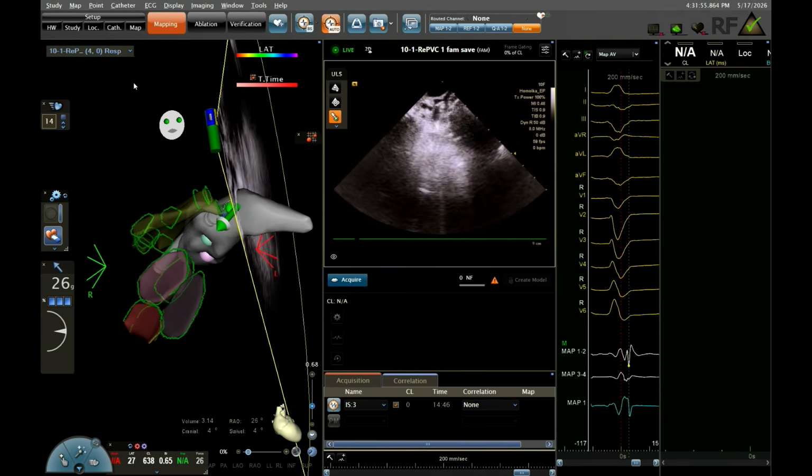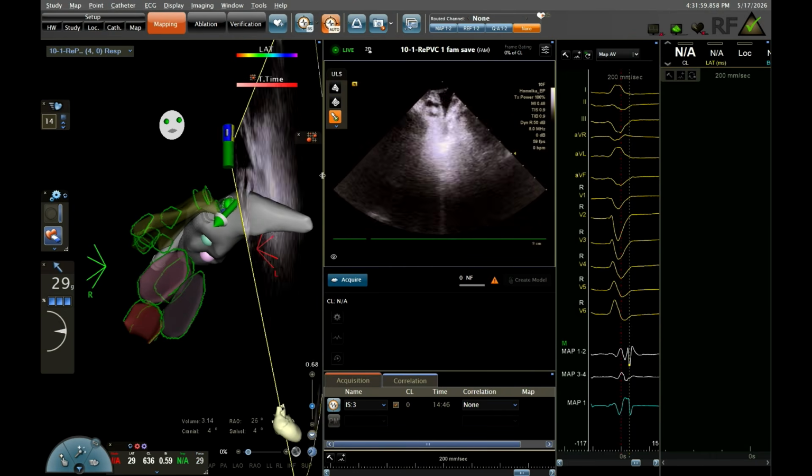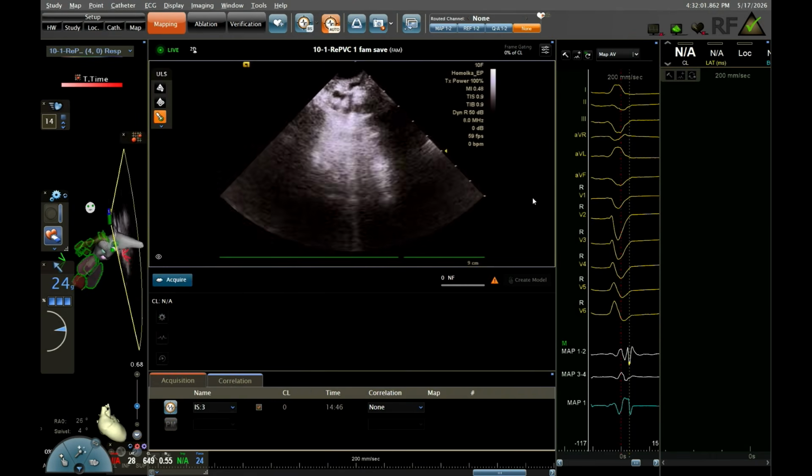Now, can you just put eyes for a minute and Carto sound? Make Carto sound big. Actually, don't put eyes, put just Carto, just Carto.